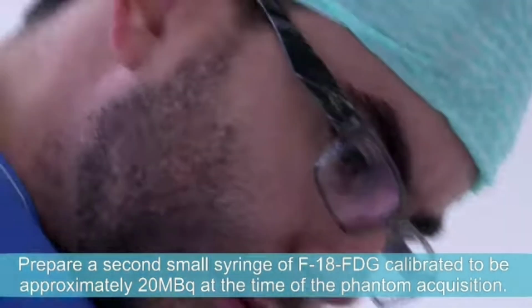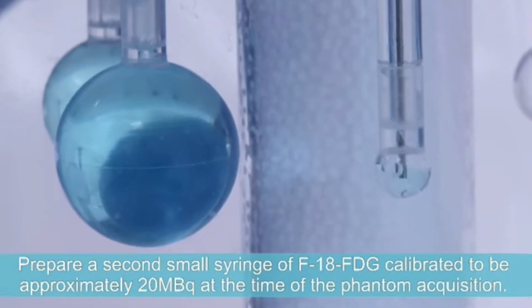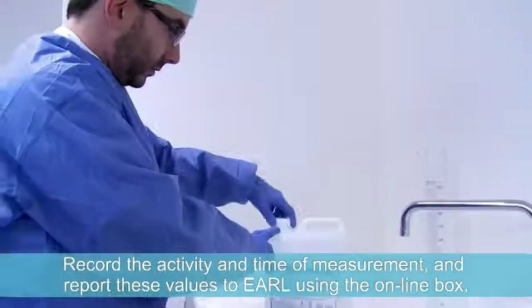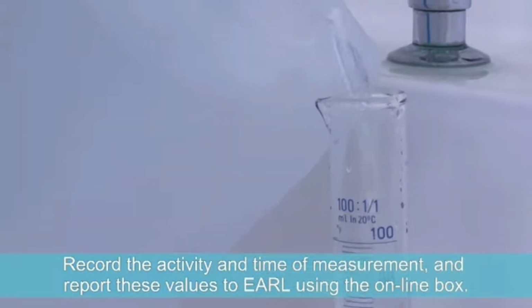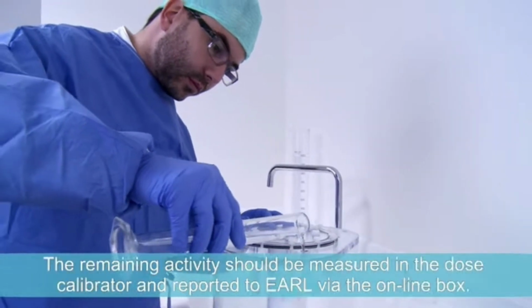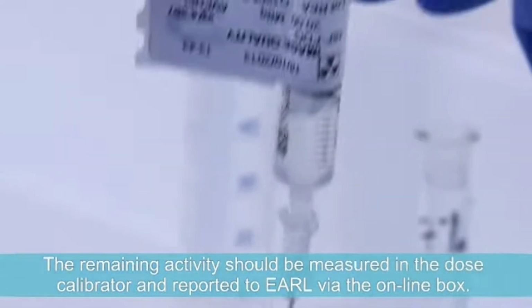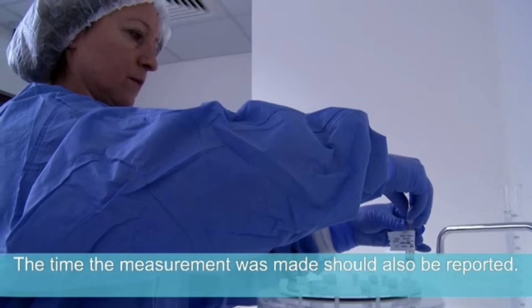Prepare a second small syringe of F18 FDG calibrated to be approximately 20 megabecquerels at the time of the phantom acquisition. Record the activity and the time of measurement and report these values to EARL using the online box. Add the activity to the water in the phantom and flush several times. The remaining activity should be measured in the dose calibrator and reported to EARL via the online box. The time the measurement was made should also be reported.